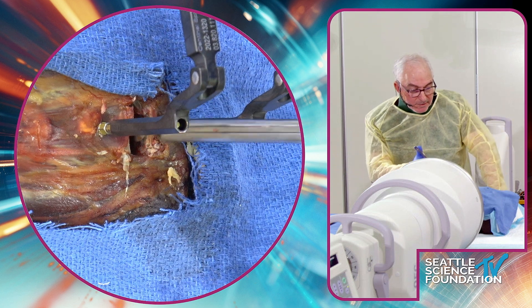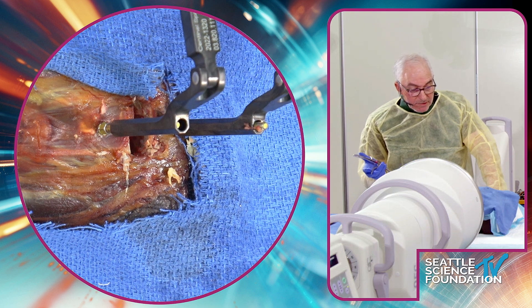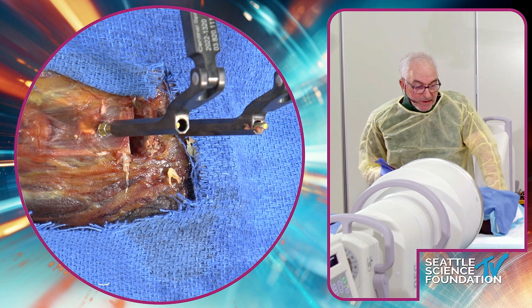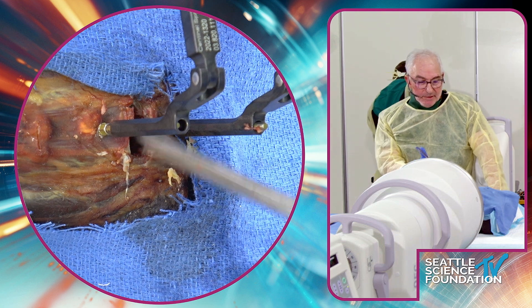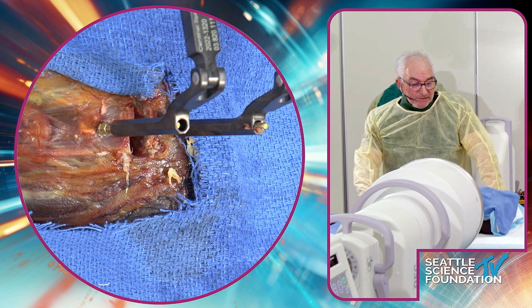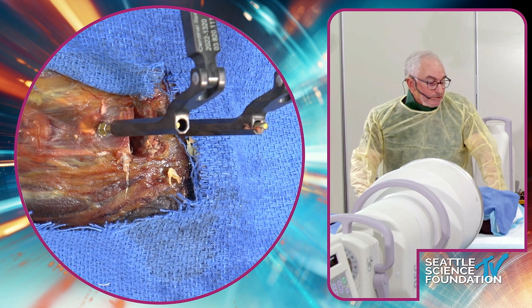If the disc is coming out for mechanical reasons, you assess the mechanical integrity of the end plate. If the pathology or your technique of taking it out hasn't compromised it too much and you've got nice end plates — and hopefully you can see here, these end plates are great — you can proceed with revision implant sizing.